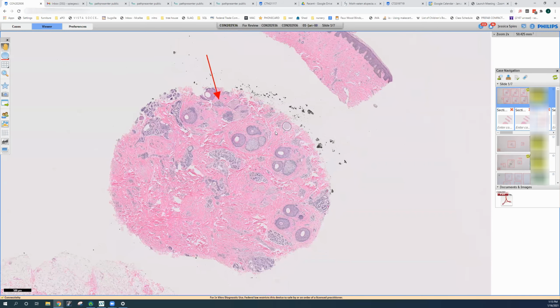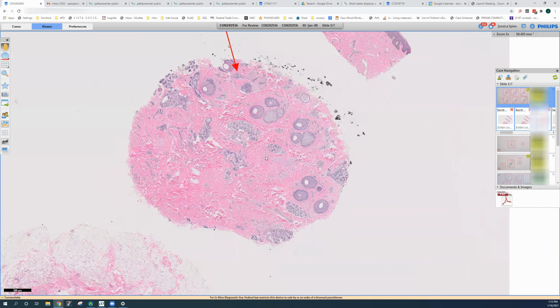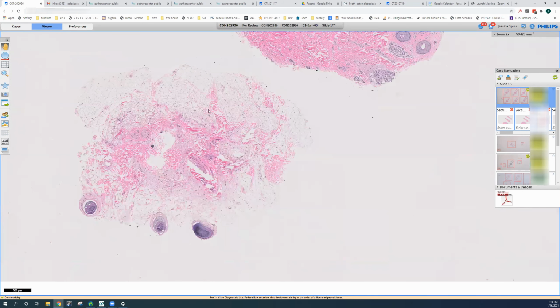And then in the superficial to mid-dermis, we've taken the bottom half of the biopsy and turned it so that we can look at all of the hair follicles in the biopsy at once. And then, so here is at the level of the sebaceous glands, the follicles, and here is the subcutaneous. And you can see we're in the scalp, we've got terminal follicles sticking down into the fat.